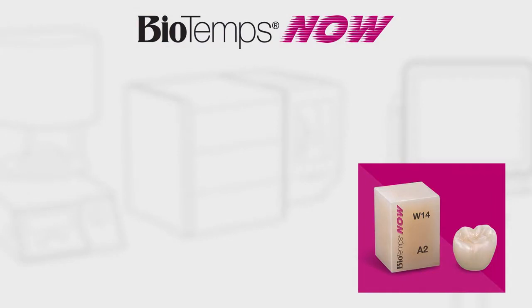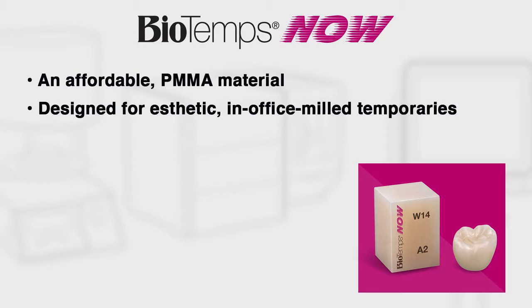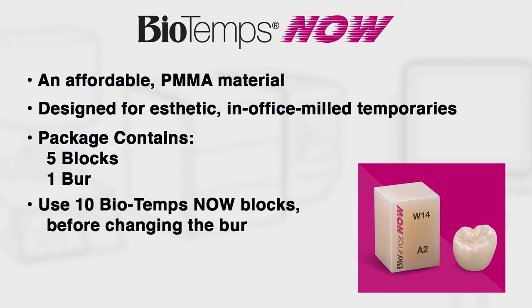And of course, our latest offering for our chairside mills, Biotemps Now. Biotemps Now is an affordable PMMA material especially designed for aesthetic, in-office milled temporaries, with shades to meet the patient's shade requirements. The Biotemps Now case comes with 5 blocks. Unlike Obsidian, Camouflage Now, or Bruxer Now, you can produce 10 Biotemp restorations per tool.